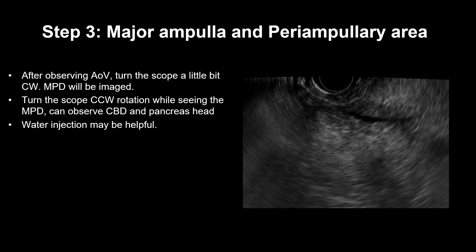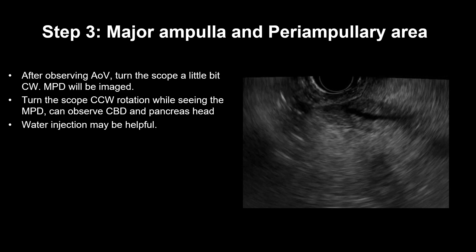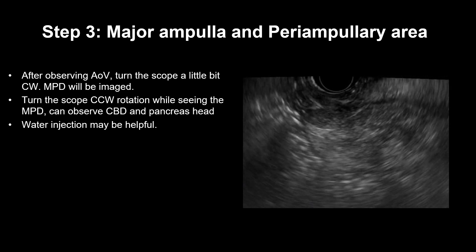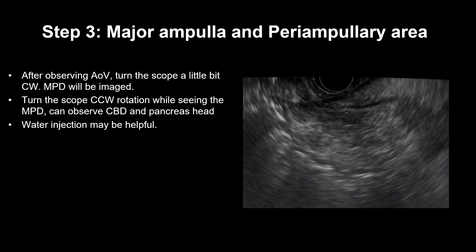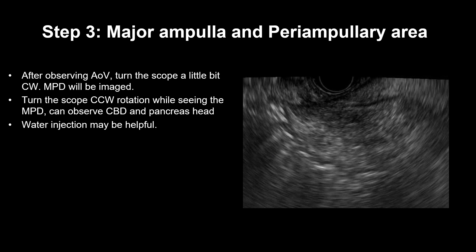Step 3: ampulla of Vater and periampullary area. After observing the ampulla of Vater, turn the scope a little bit clockwise — we can see the main pancreatic duct area. Turn the scope counterclockwise — we can see the CBD area. Water injection may sometimes be helpful to visualize the ampulla of Vater and the pancreatic head area.